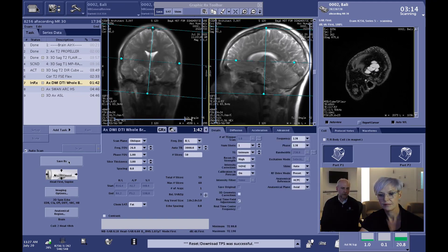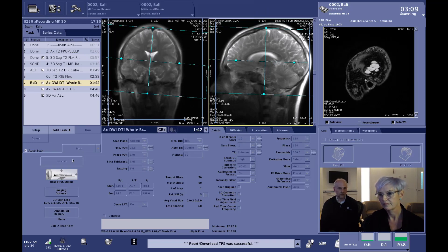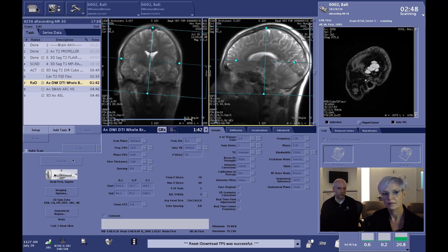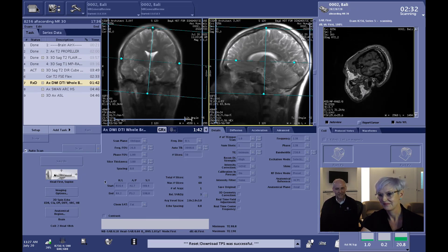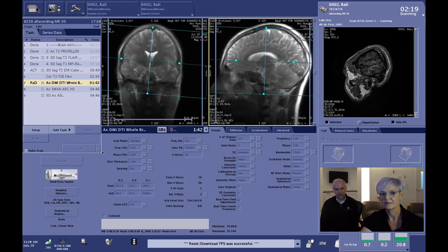This example uses a single B value — a single shell of 1000. It is also possible to run this as a multi-shell acquisition, applying Air Recon DL across multiple shells and defining the number of directions at each B value. This is beneficial for higher B values, such as a B value of 3000 as used in research studies like the Human Connectome or ABCD project, which inherently have less signal. Air Recon DL helps address that, and it's even possible to push to a B value of 4000 on a multi-shell DTI acquisition, where Air Recon DL is a significant advantage.